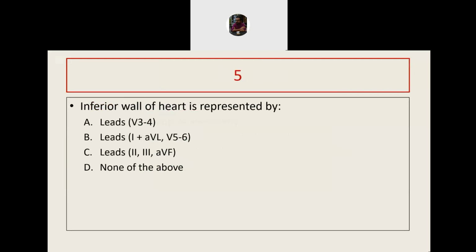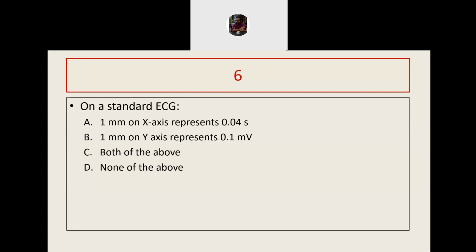Very good. Leads 2, 3 and AVF. On a standard ECG, which one is true? Very good. Both of the above.